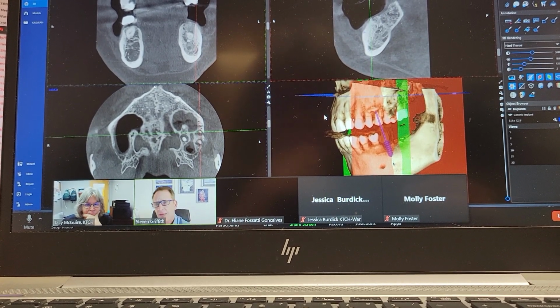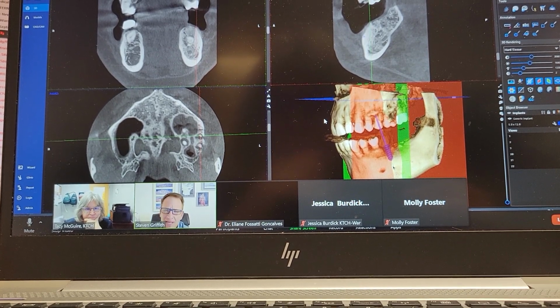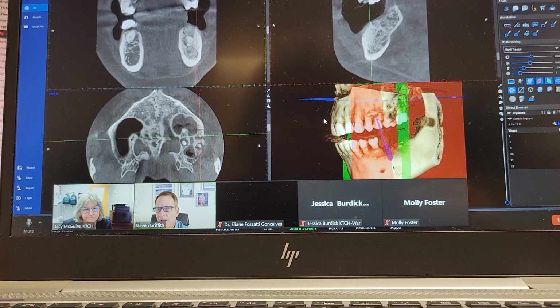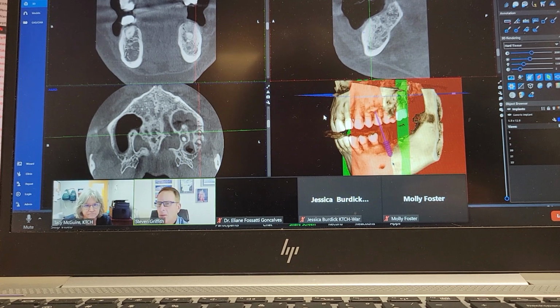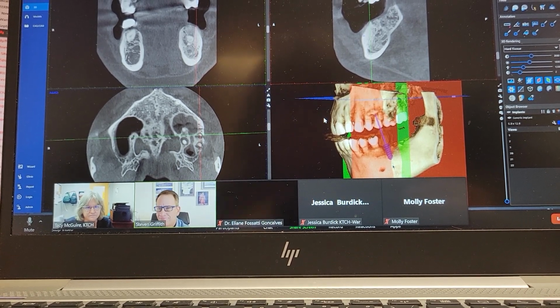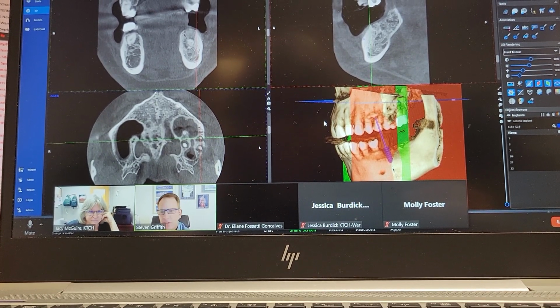But here's the other thing. Guys, 2Ds aren't perfect. A 2D can vary from patient to patient, all depending on how cooperative they are and their anatomy. That's the problem with 2D. With 3D, you could take any Tom, Dick, or Harry, put them in there, and still get a good image. Wow. 3D is easier than 2D. 2D is just more difficult.